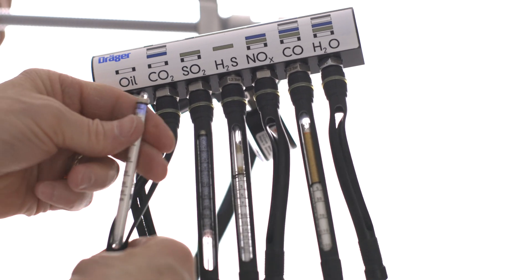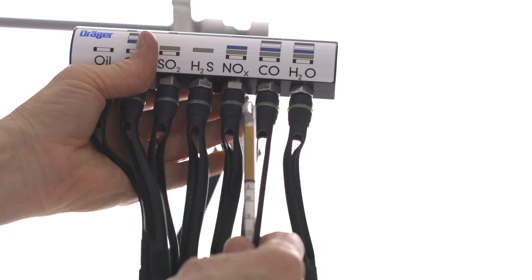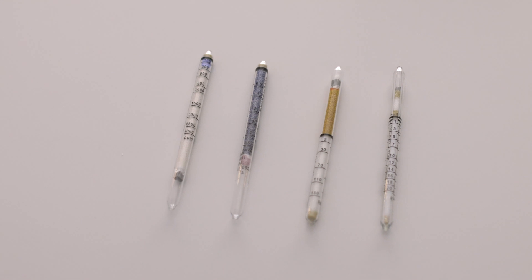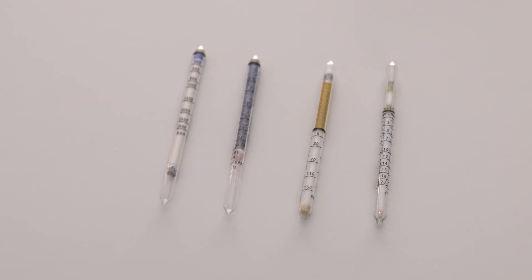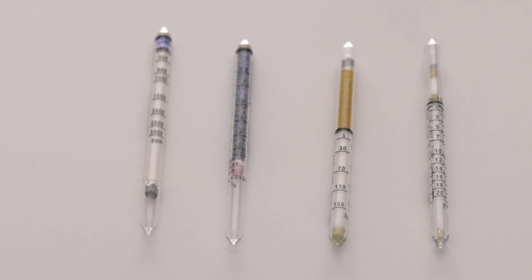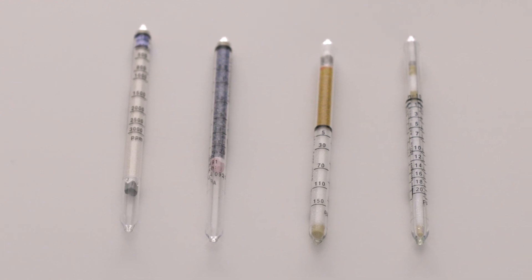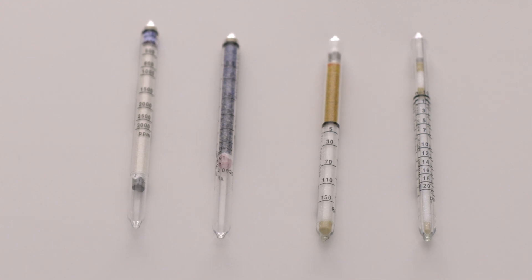remove the impactor, carbon dioxide, sulfur dioxide, hydrogen sulfide, and carbon monoxide tubes. The discoloration on the carbon dioxide tube reached 270 ppm, but there are no visible discolorations on the indication layers of the sulfur dioxide, hydrogen sulfide, and carbon monoxide tubes.